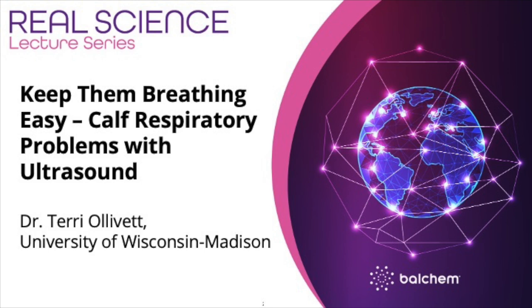All right. I'll just add one thing, because if you start doing this, you have to realize, if you're a veterinarian or the producer, if you start finding disease sooner and you're using a more sensitive tool, you might panic when you see the list of calves that need to get treated. Don't panic. The disease level hasn't changed. You're just finding them now. But they're going to perform better after you get them treated sooner. So be okay with that. Be prepared for that. And if you're a veterinarian or somebody that's going to be doing the scanning, make sure you warn the operator that this is going to happen so they don't get scared, saying, oh my gosh, we have twice as much disease. For every clinical calf out there, we can expect 2 to 4 subclinicals.